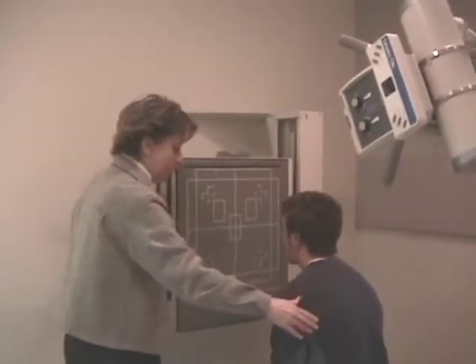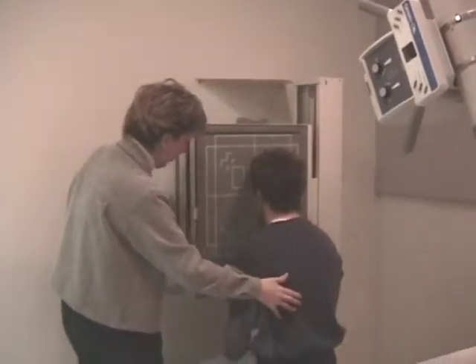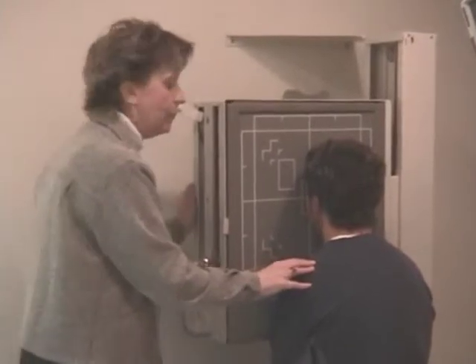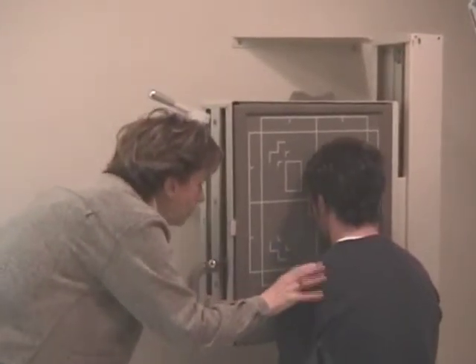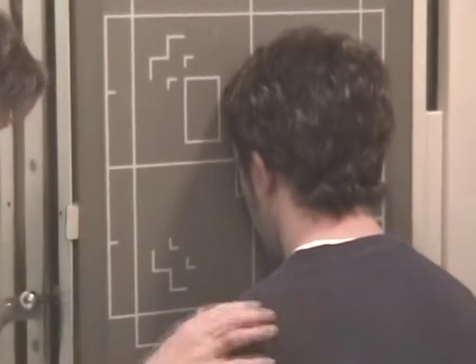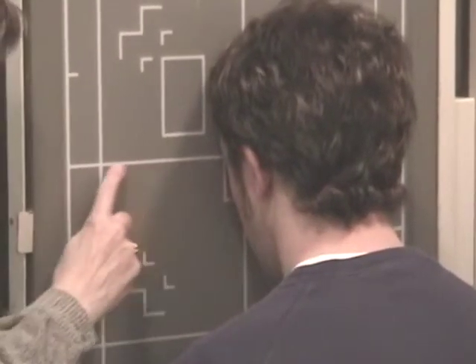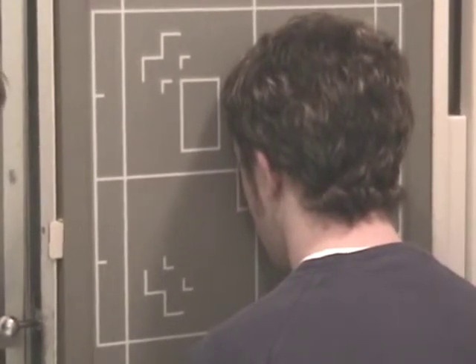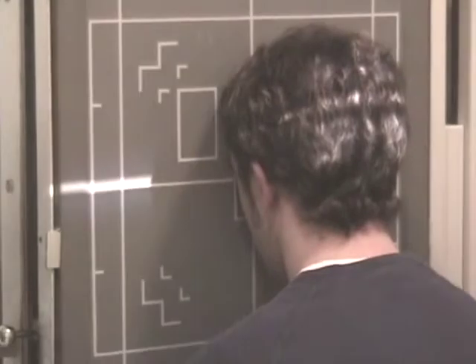I'm going to have my patient scoot up to the vertical board, and remember, a PA is a PA is a PA. We're going to tuck his chin until the orbital meatal line is perpendicular. And I'm going to look at this line again, and for sinuses I want that CR to exit right through the nasion. 15-degree caudal tube angle. Make sure things line back up.